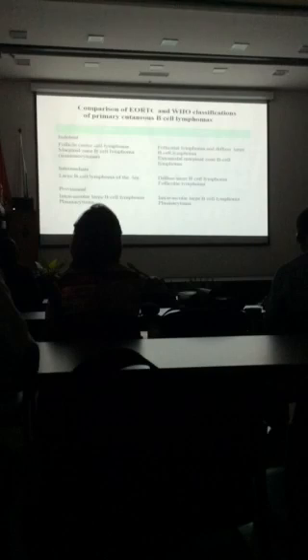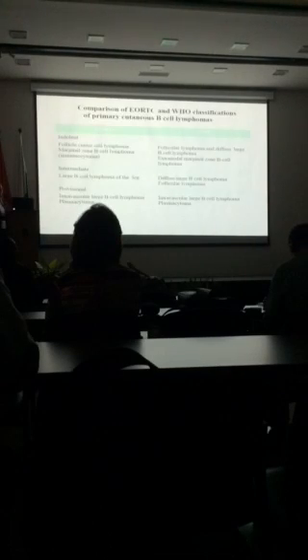Then the other types are very rare. The T-cell histiocyte-rich large B-cell lymphoma and intravascular large B-cell lymphoma is still a provisional entity, but this is really primary cutaneous.